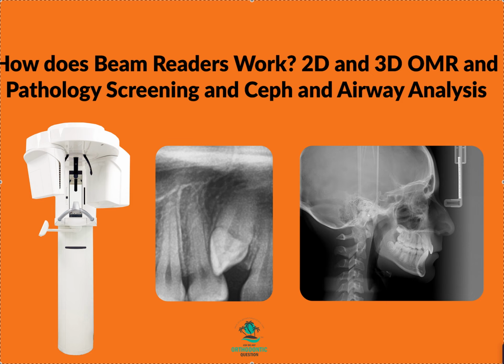So you can do this if you upload a CBCT where the field is big enough, and let's say you need a Ceph slice, they can take a Ceph slice out of it. And from the Ceph slice, they can turn it into a Ceph. And that price point is more than 50, less than 100, let's put it that way. And it takes a few days. If you need it faster, within a day, there's a rush charge. It's still less than 100, unless you have volume.